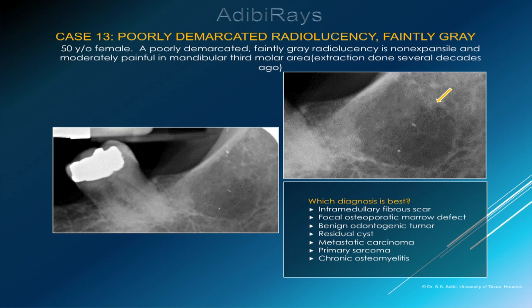Intramedullary fibrous scar, focal osteoporotic marrow defect, benign odontogenic tumor, residual cyst, metastatic carcinoma, primary sarcoma, chronic osteomyelitis.